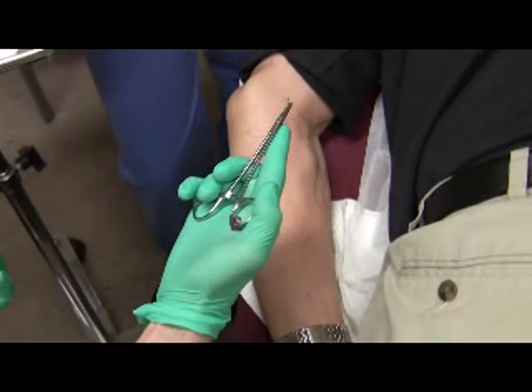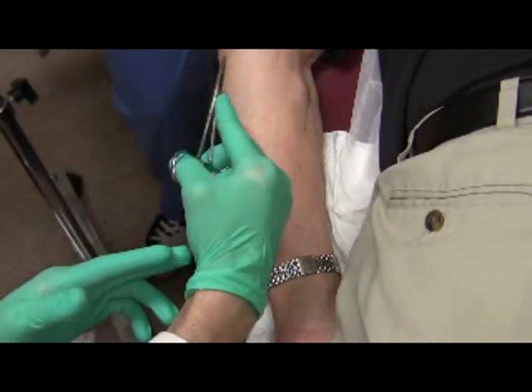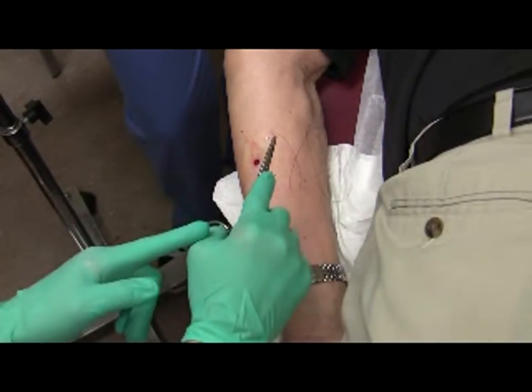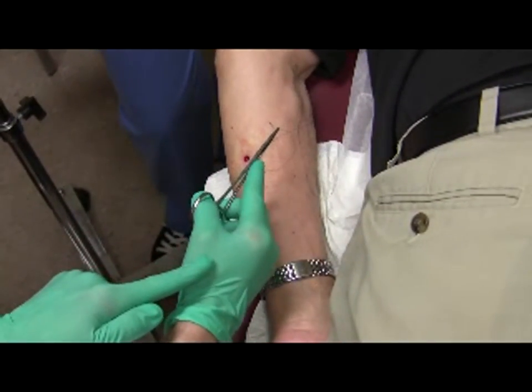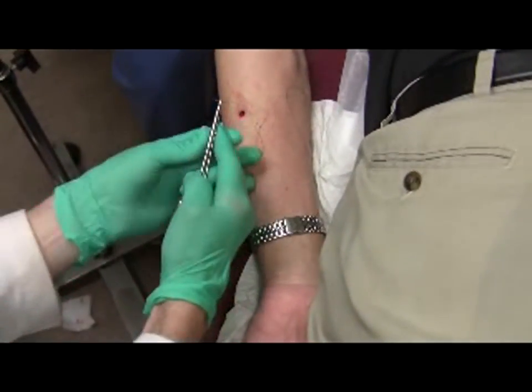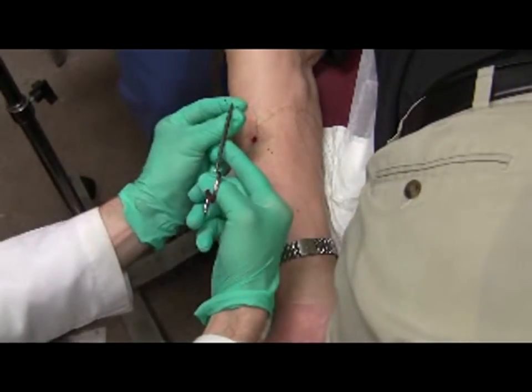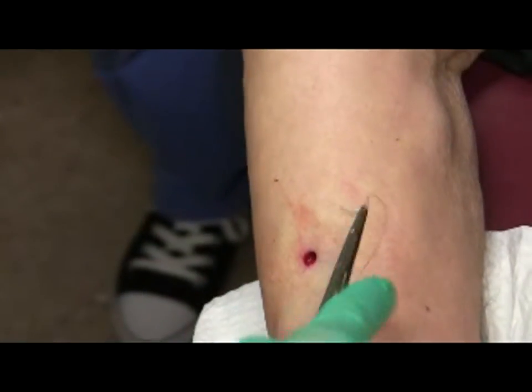If you have your fingers in the loops, the tendency is to bend your wrist instead of twist your arm, and when you bend your wrist you can sometimes bend the needle. But if you keep your wrist straight and still pronate and supinate while your fingers are in the loops, you can have the same action either way. The beauty of having fingers in the loops is when you're ready to take the stitch out, you can undo the thing, grab the stitch, hand it to yourself, and grab the stitch again without constantly turning it.